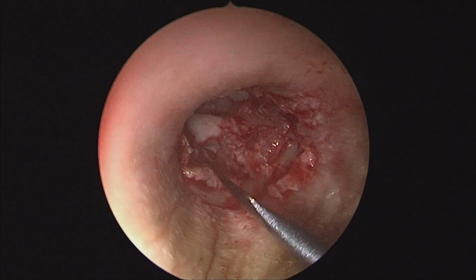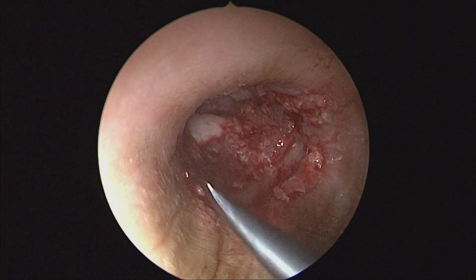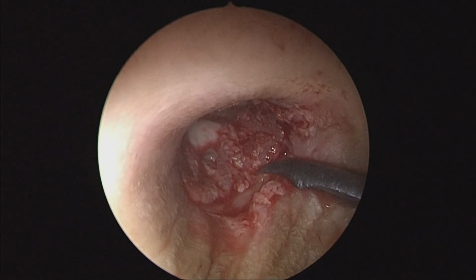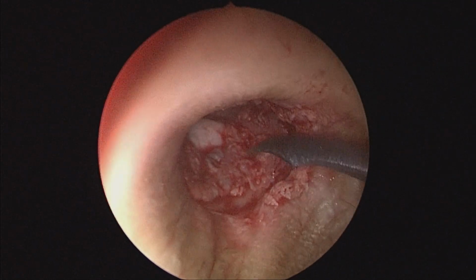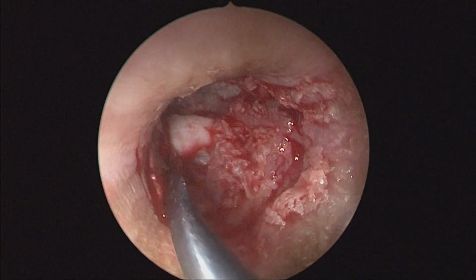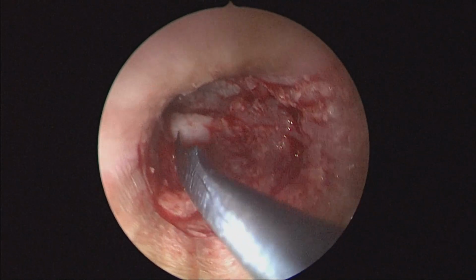Now once that is done, we replace the canal skin, tympanomeatal flap, and as you see that our perforation is well covered. Some little bit of bone is bared on the posterior superior canal wall, but that should epithelize reasonably fast.